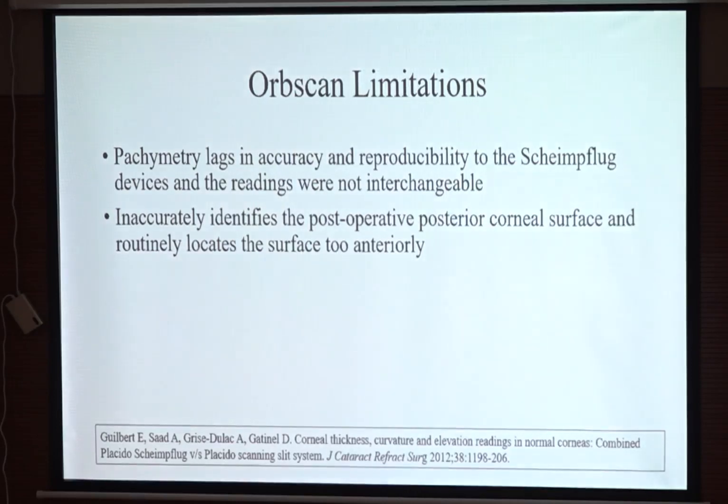So what are the limitations of OrbScan? It lags in accuracy and reproducibility as compared to Scheimpflug imaging devices.